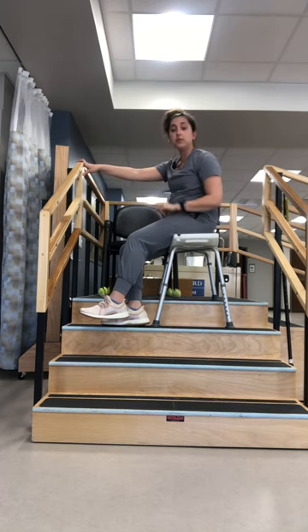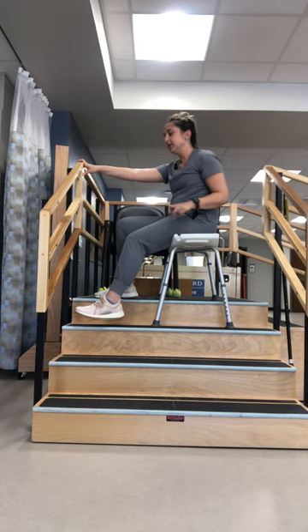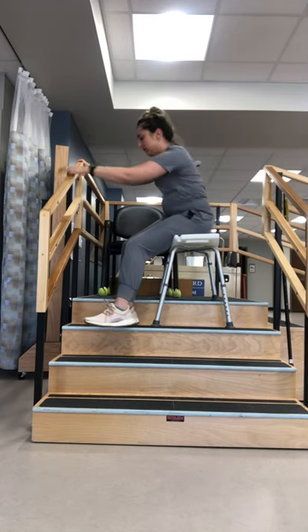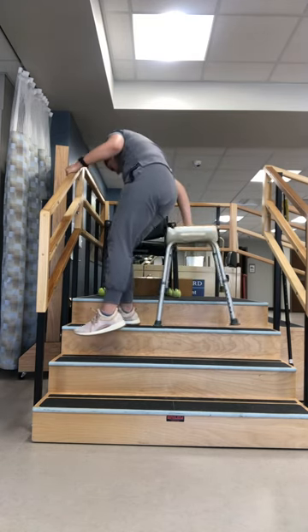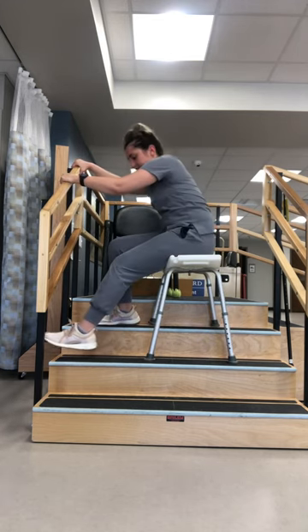If you can't do it yourself, you can always have a loved one be with you to help move the chair. Same idea on the way down — you're going to move your good leg down and advance your shower chair.